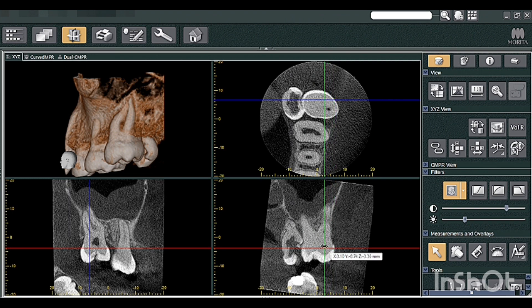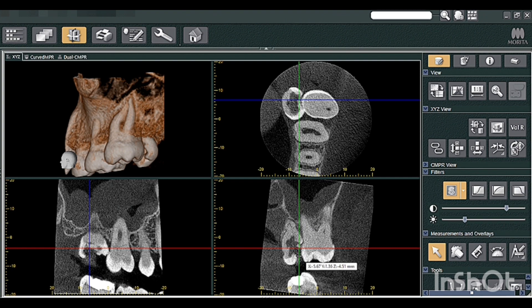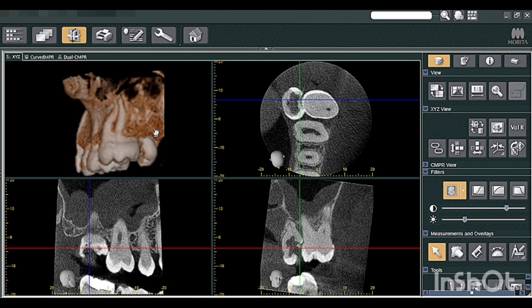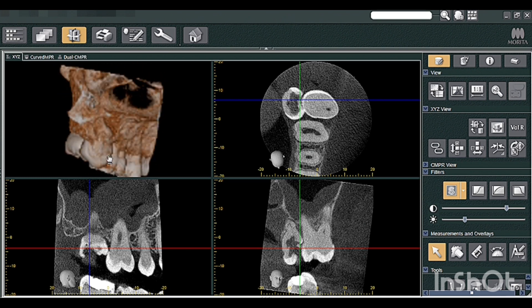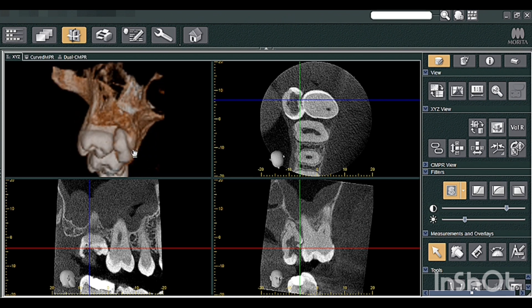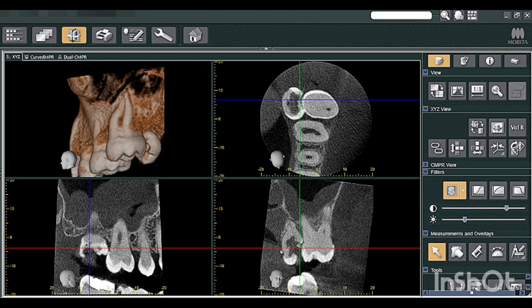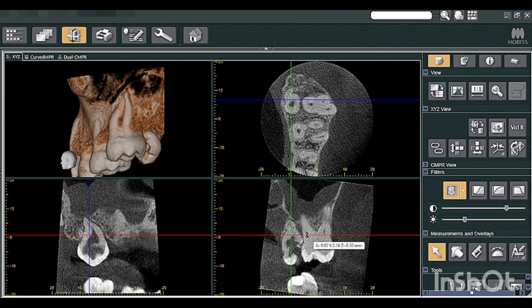This is the buccal aspect — the meso-buccal and disto-buccal roots of 26. Going inside palatally, this is the palatal root, and this is the start of tooth 28 — or you can say an impacted supernumerary — but I feel this looks more like a third molar which is palatally placed and away from its original position in the second molar region. This tooth is grossly decayed. You can see in the axial section that it is palatally placed and in contact with the sinus floor.